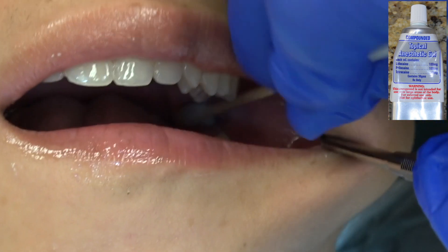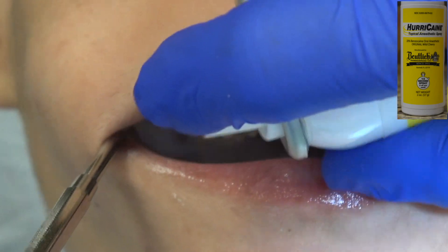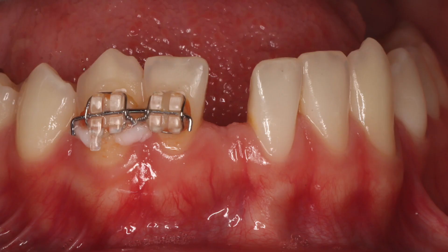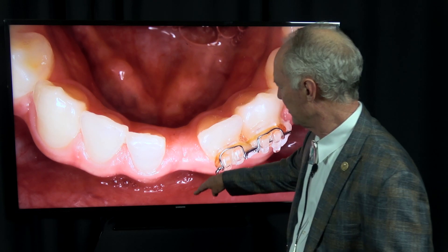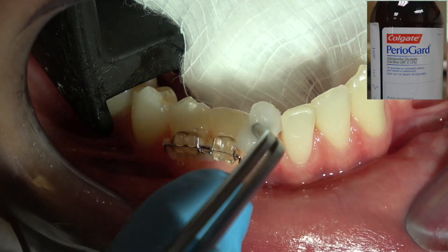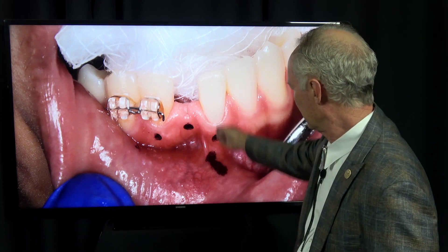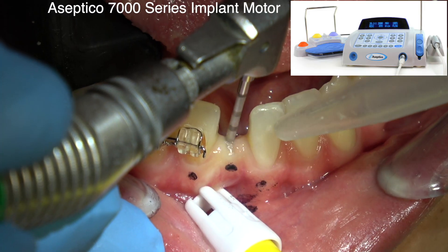First of all, we're going to administer painless and profound local anesthesia. I'm going to anesthetize both left and right of the mandible just because that tooth is sort of in the center and I don't want to take a chance on the patient having any discomfort. I want to hit the middle of the spot and be maybe just a tiny bit to the lingual if possible. This is PerioGard chlorhexidine — just wiping the spot, drying it, and I'm marking the root of the adjacent teeth and the center of the edentulous area.